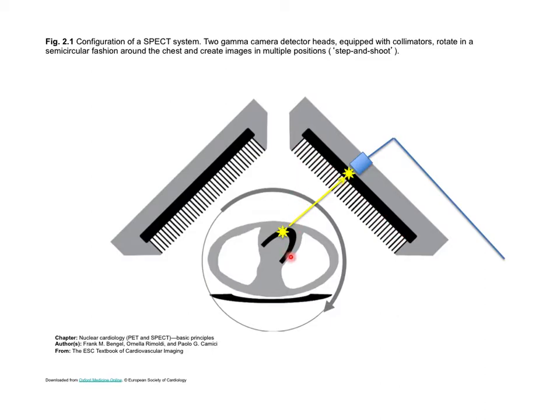And so if I have a photon that occurs here and comes at this angle and hits the detector here, the detector would mislabel that as an event that's occurring down here, right? So you don't want that. You put in these septa to basically stop photons that are coming at angles, and this detector only looks straight down, ideally, right?